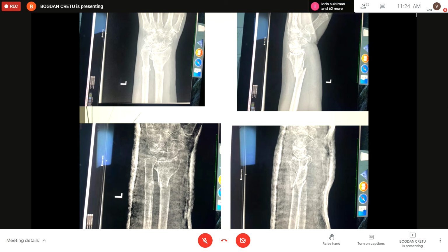With those kinds of lesions, if we used an immobilization like in those images, a cast that is too tight, it could cause compartment syndrome. The most frequent areas where compartment syndrome arises are the forearm and the lower leg.